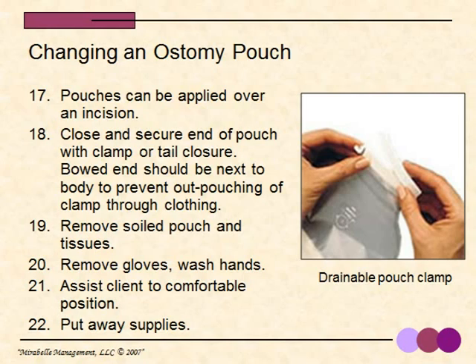Just so you know, pouches can be applied over an incision. Incisions are sealed within 24 hours of surgery.